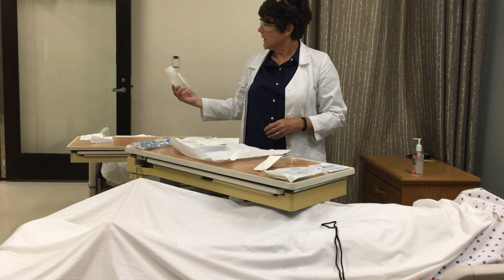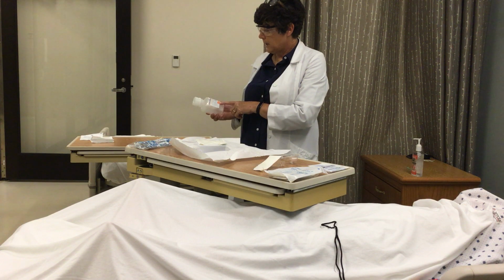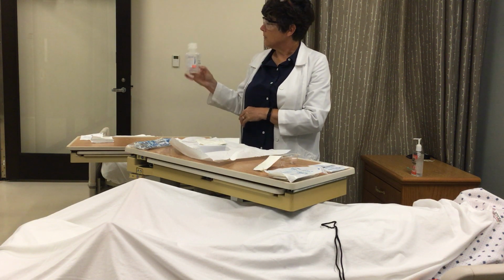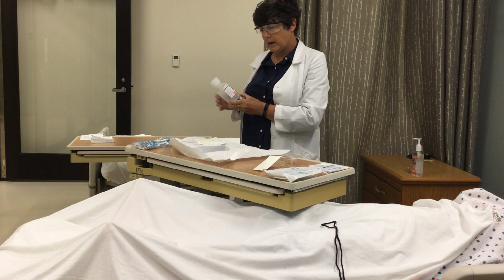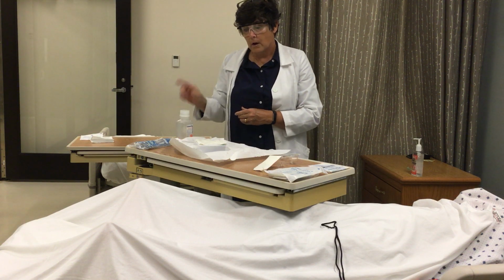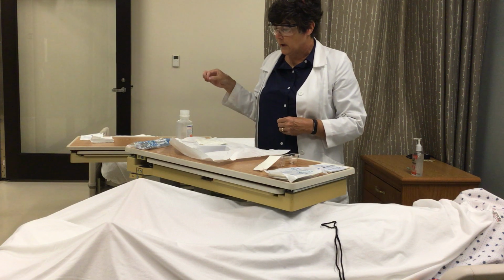I would make sure I have the correct solution. I would check the expiration date on this. If it has been previously opened, I would make sure it's been within 24 hours. If I'm opening it and it's brand new, then I need to put the date, time, and my initials on that container. Before I pour it, I have to do a couple things in relation to this kit.